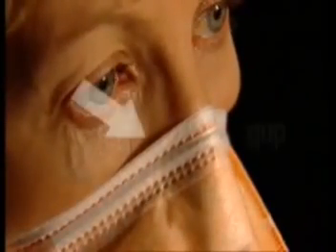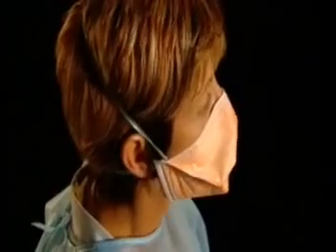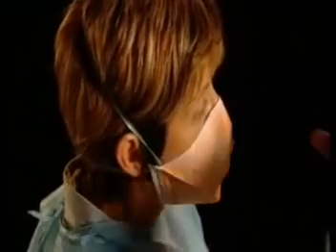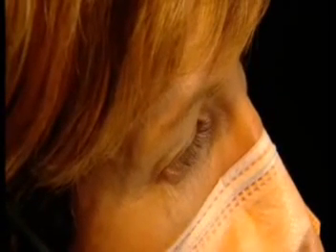At times there can be a remaining gap near the bridge of the nose. To remove this gap, stretch your nose by dropping your jaw and pinch the mask around the bridge of your nose. When fitting your mask, it may be helpful to have a mirror nearby so you can visually check the placement on your face.